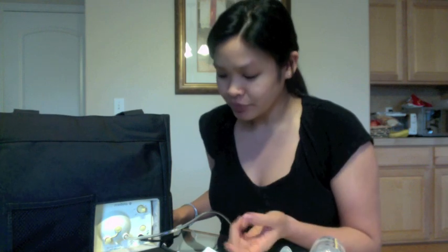Sometimes in the middle, your boob starts to dry out, but there's still milk in there and you need a second letdown. Go ahead and just press the button again. It'll start the baby, first suction things again. And then once your milk starts flowing again, go ahead and just press the button again. And then those long drawn pumps will start again.